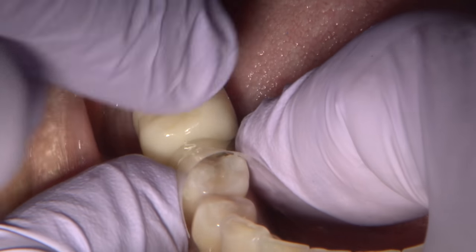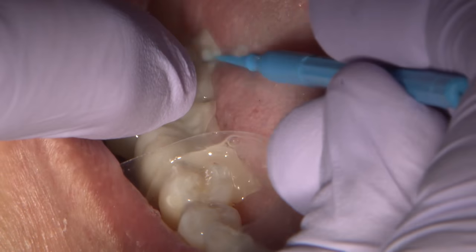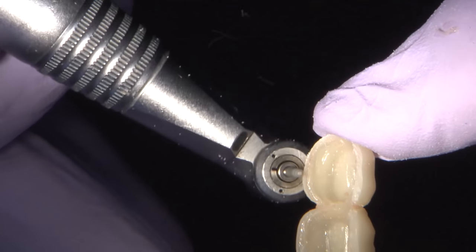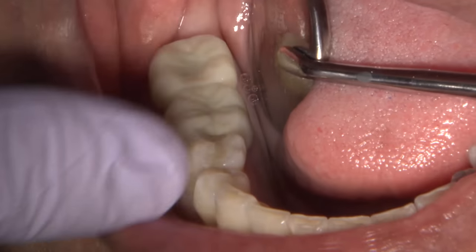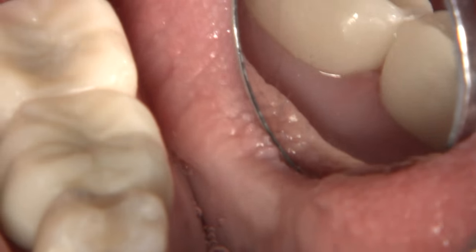Number 30 and 31 were provisionalized with splinted Biotemp CAD. You can see here my assistant takes great care that the previously relined Biotemps will have good margins, and opens the interproximal embrasures to provide room for an interproximal proxy brush or floss thread to facilitate cleaning.